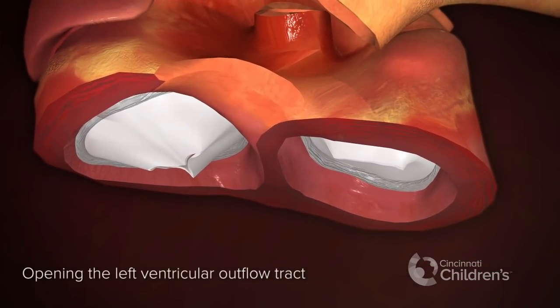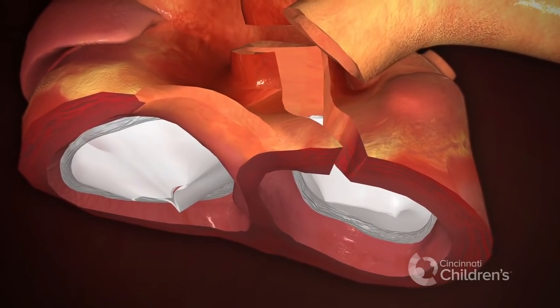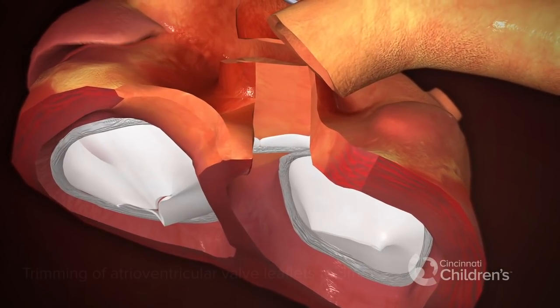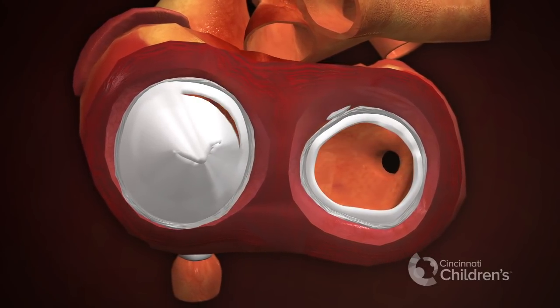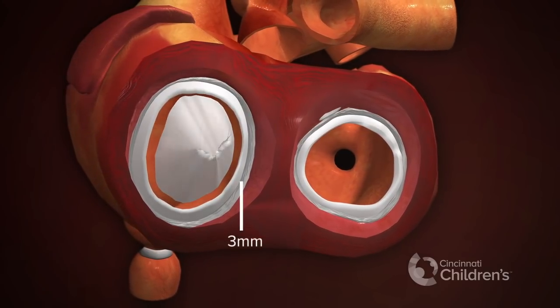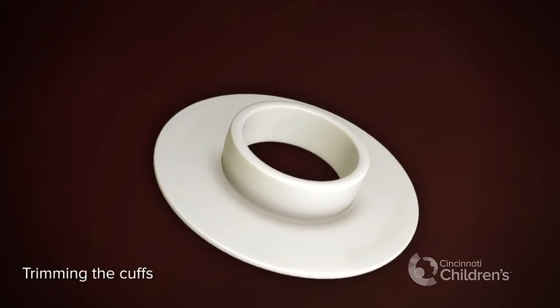Opening the left ventricular outflow tract. Trimming of atrioventricular valve leaflets to three millimeters. Trimming the cuffs to three millimeters.